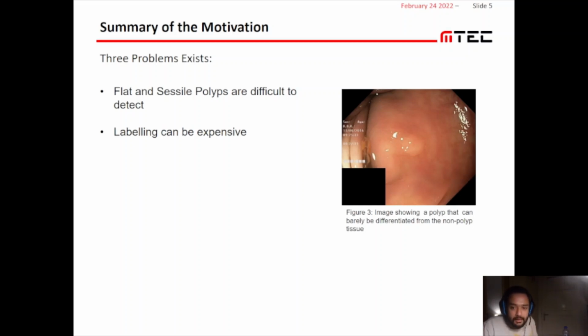Generating segmentation maps in particular takes more time in comparison to generating classification datasets. Furthermore, if two or more people participate in the creation of segmentation maps, inter-observer variability exists in the ground truth labels. This adds uncertainty to deep learning model predictions. Therefore, we want to train models that use fewer ground truth labels but still segment accurately.